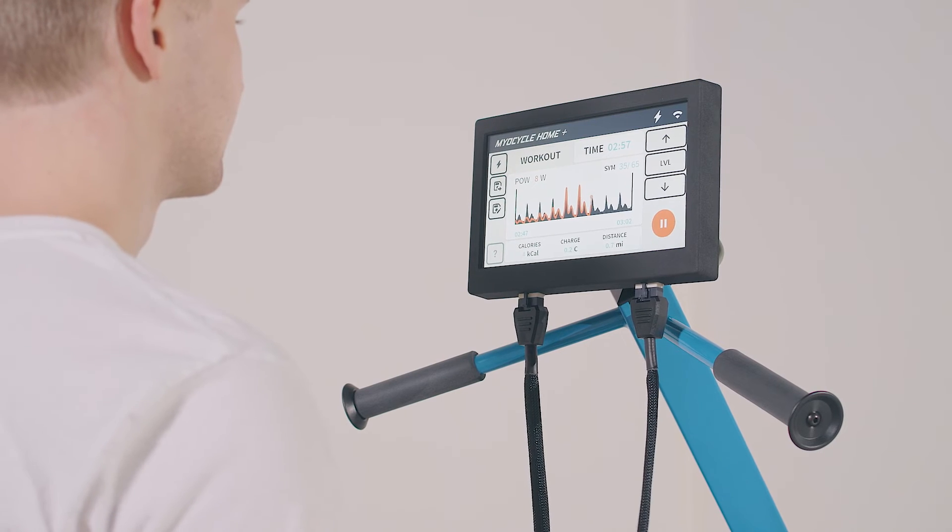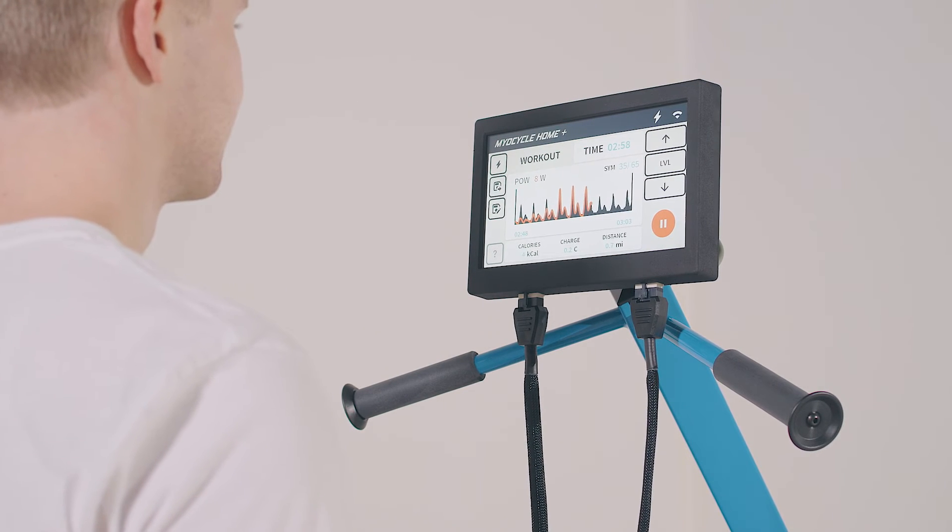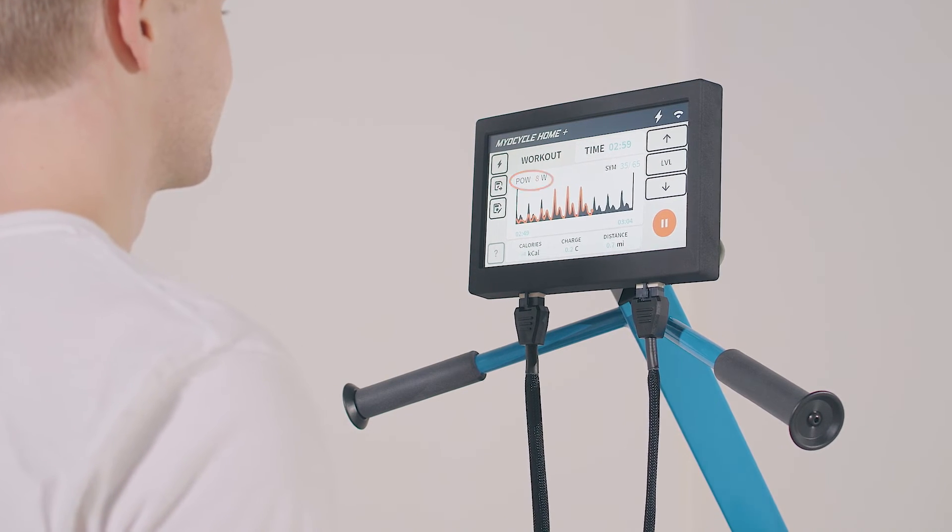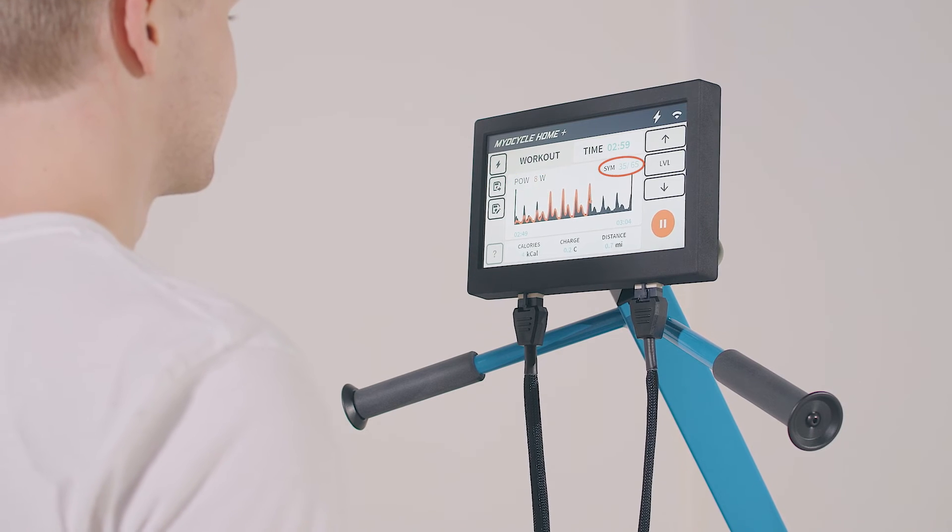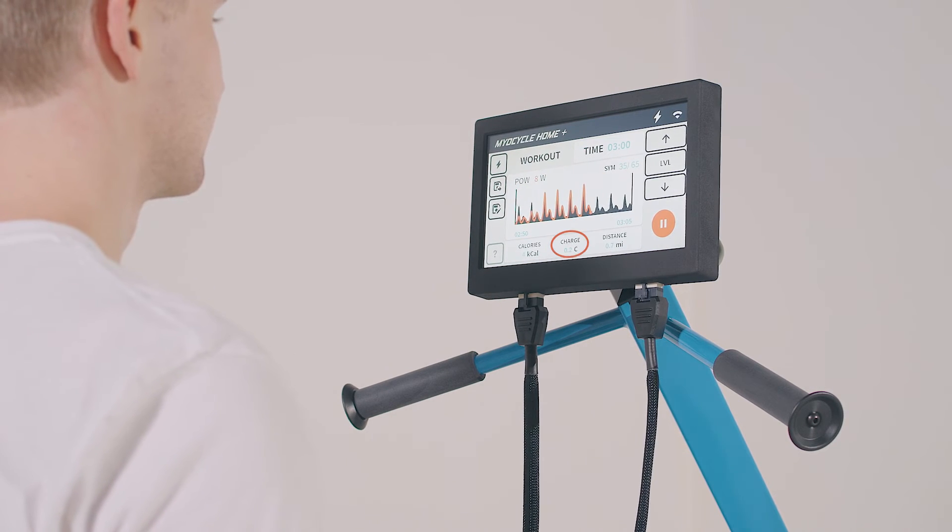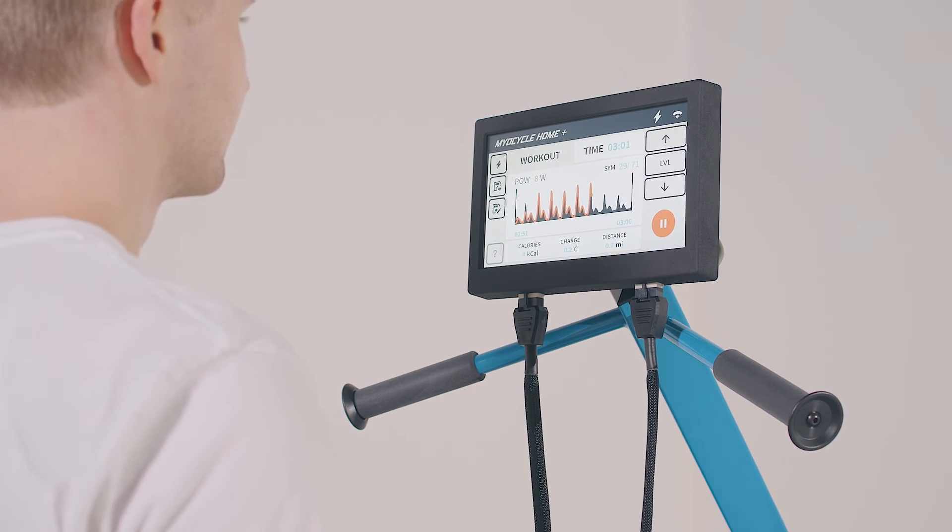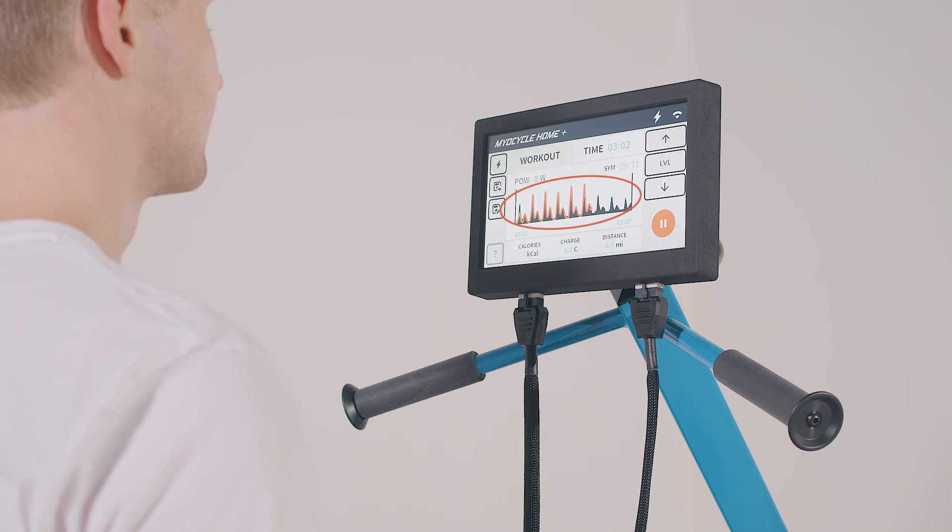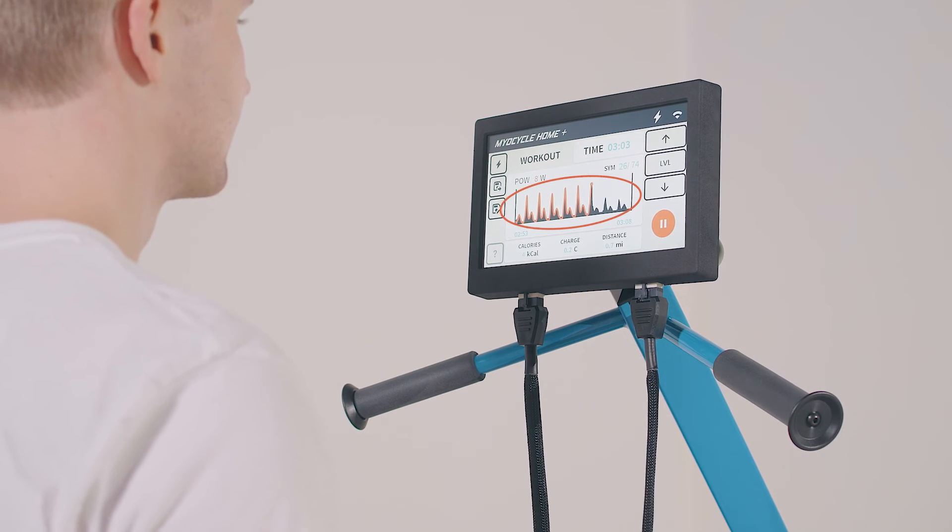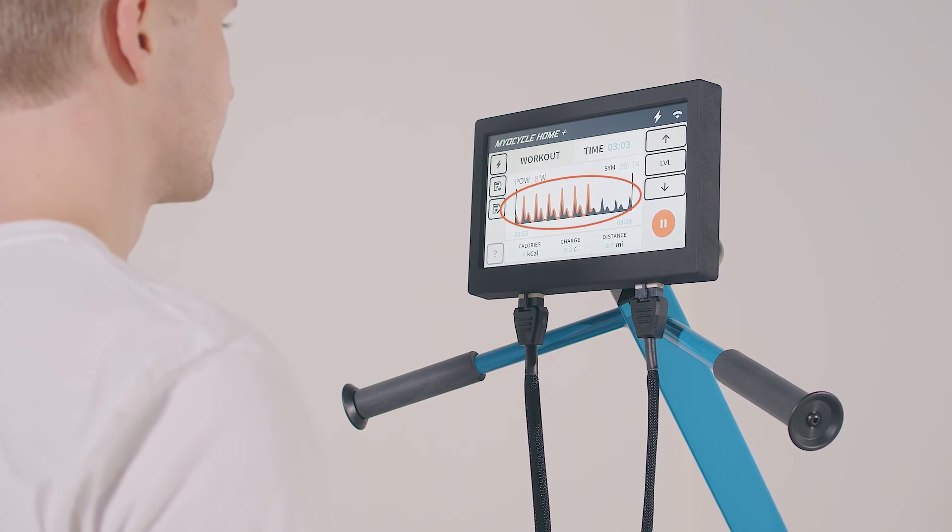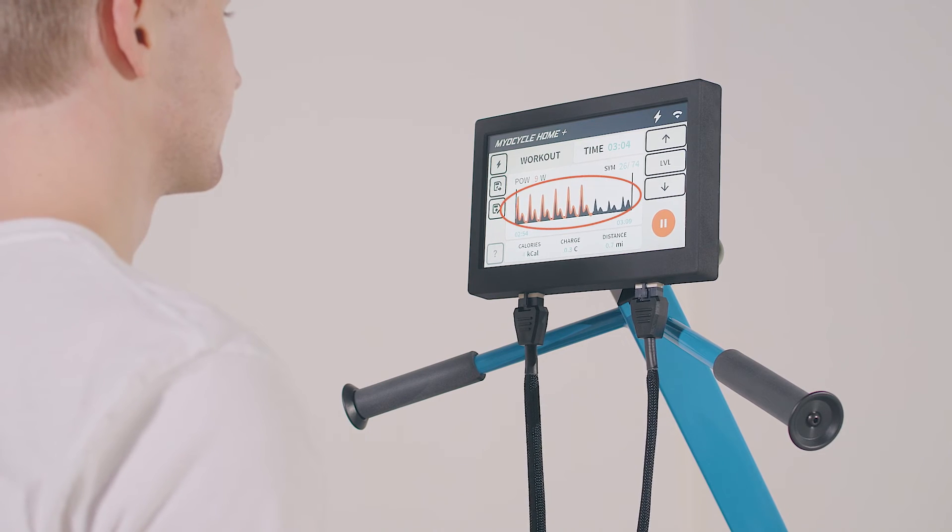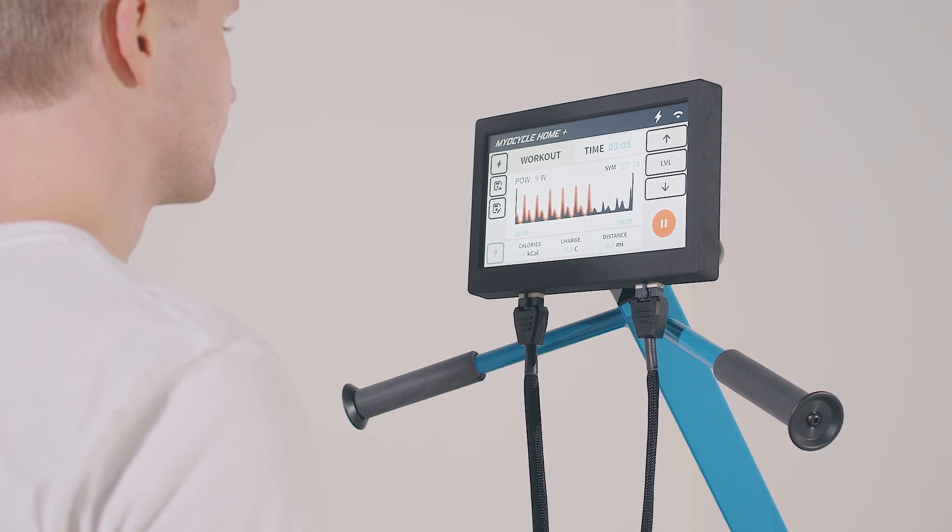During your workout, you can view the power display to see an array of metrics like power output, symmetry, calories, charge, and distance. This screen also features a real-time power plot to show you how your power output is changing throughout your workout, and even compares it to your previous best.